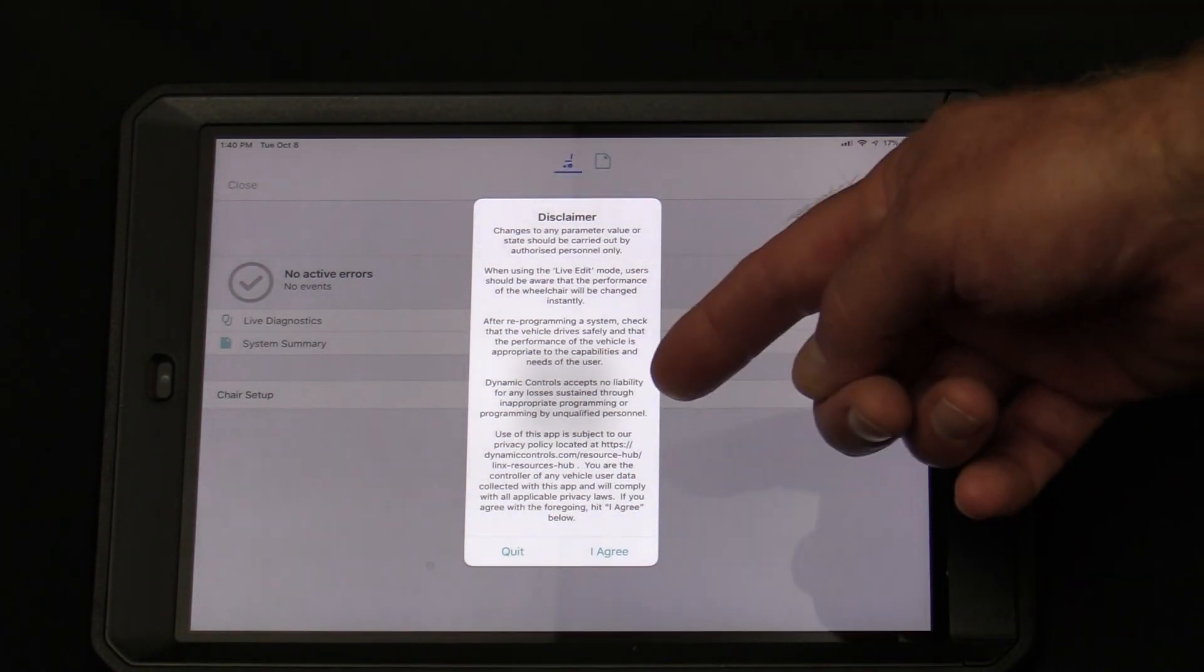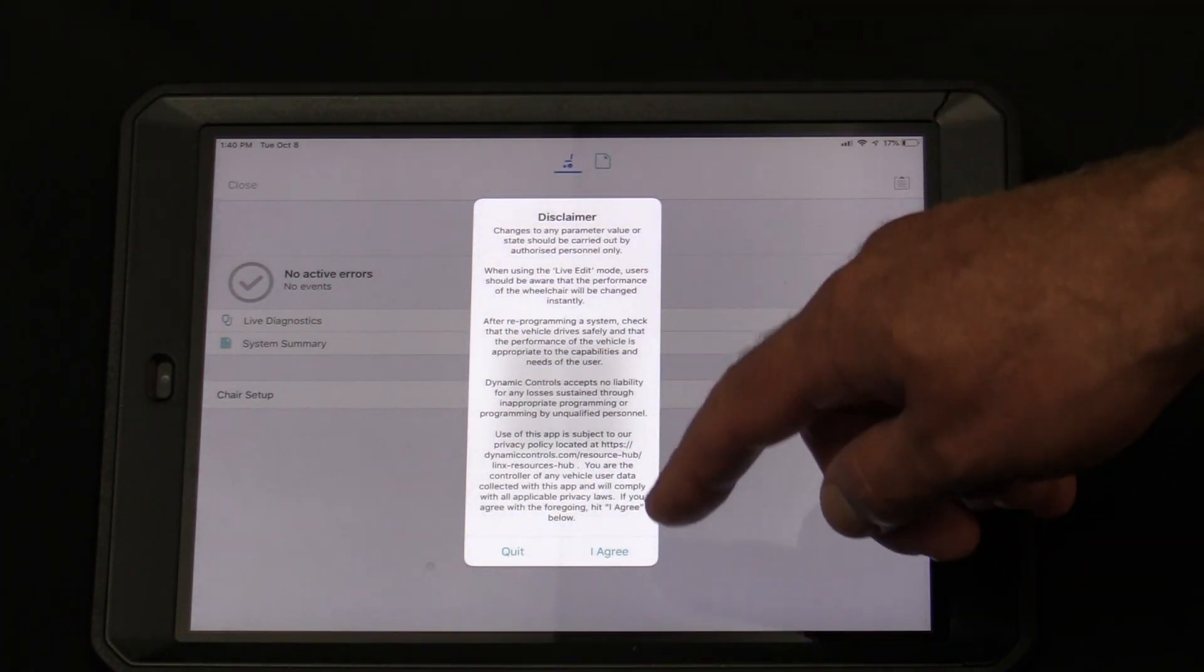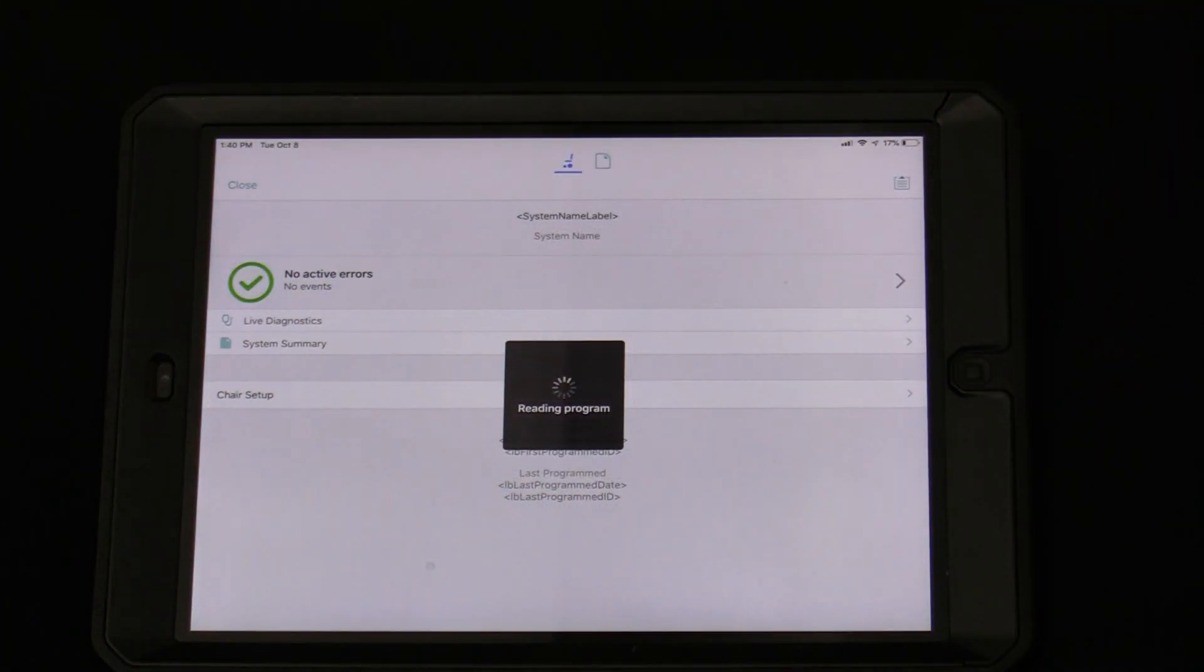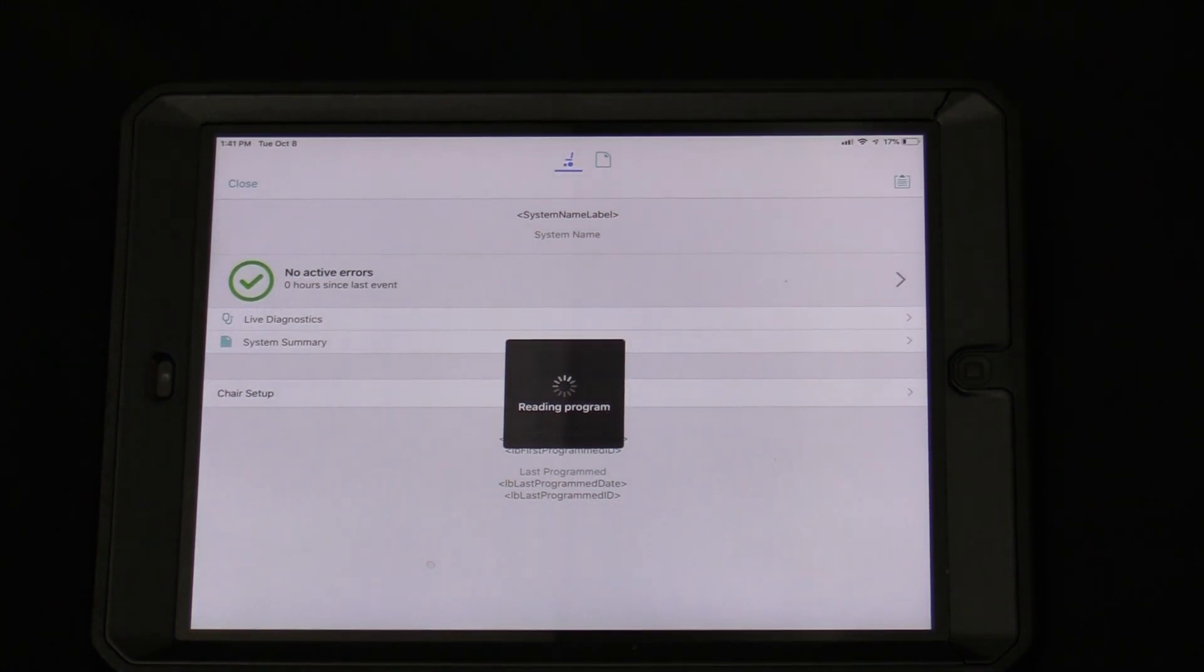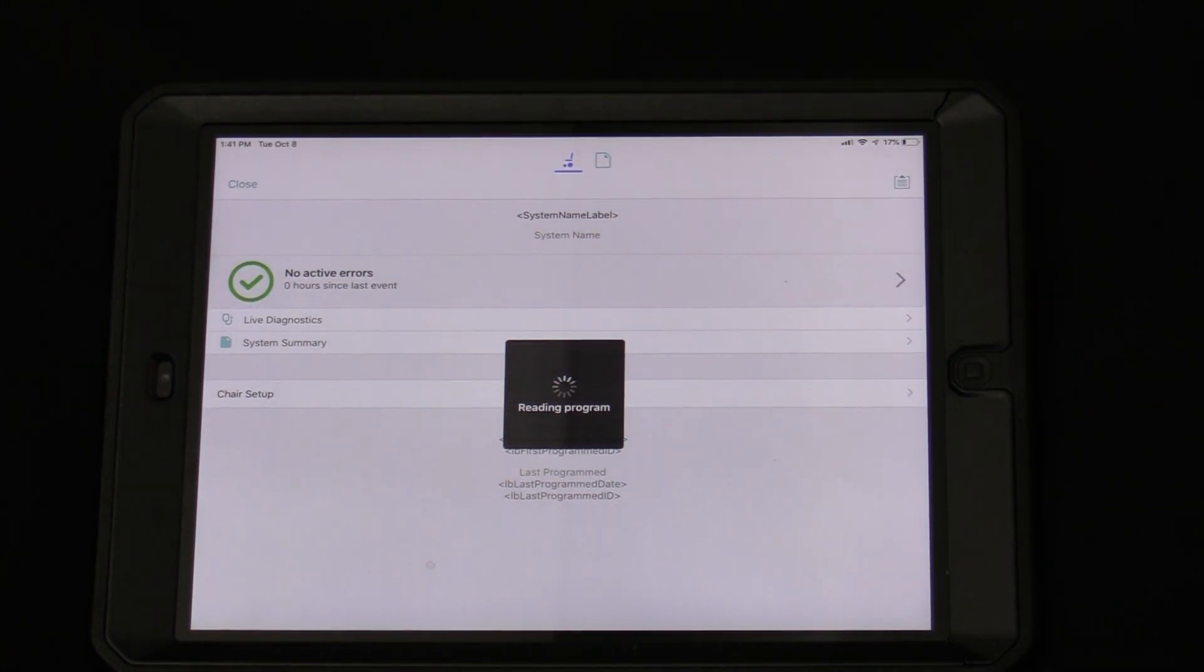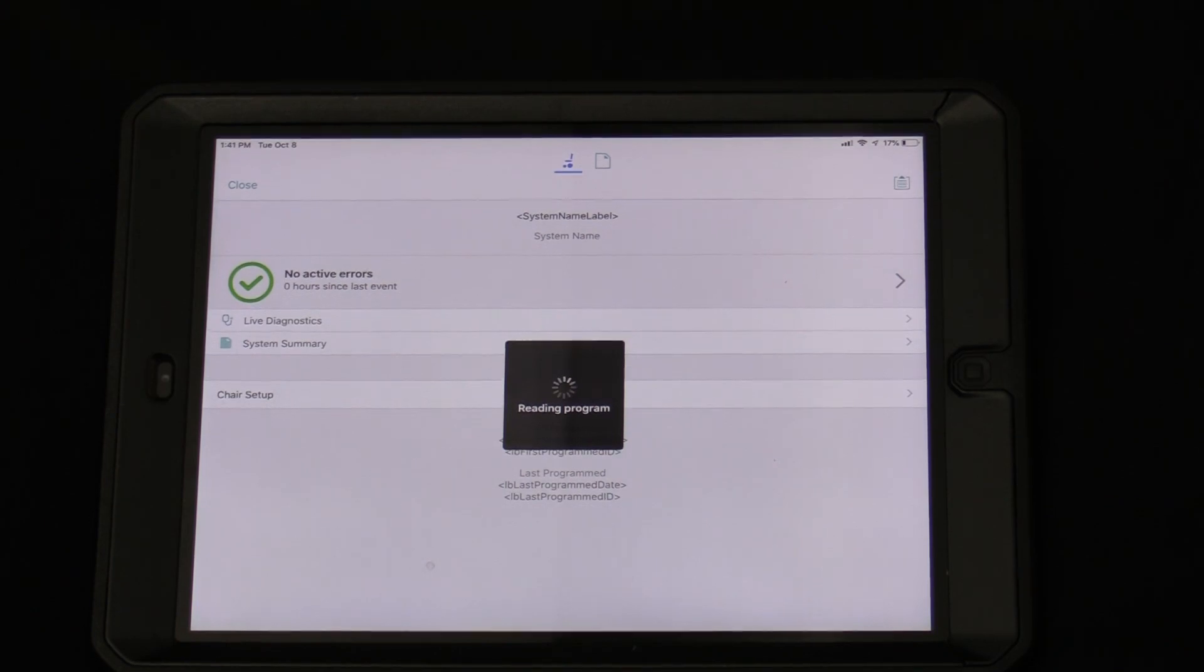Read the disclaimer, and then tap I agree. The app will take a few moments to read the chair's program. Once complete, you're ready to begin programming.